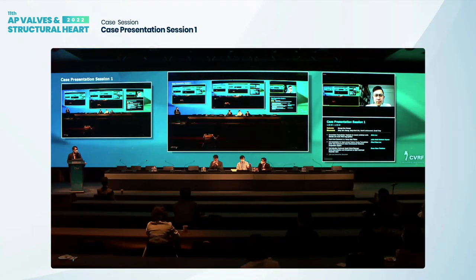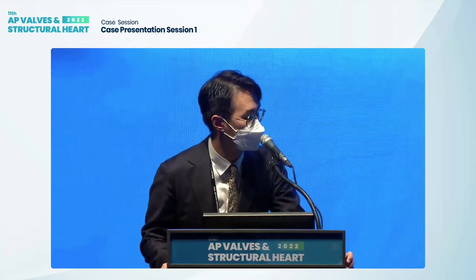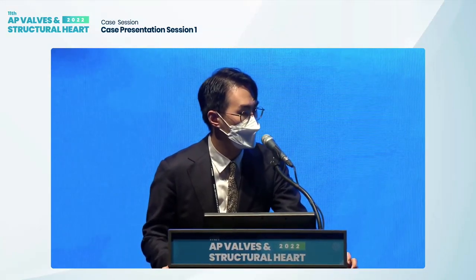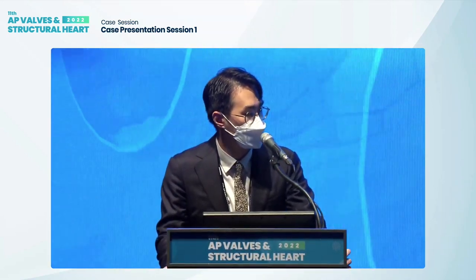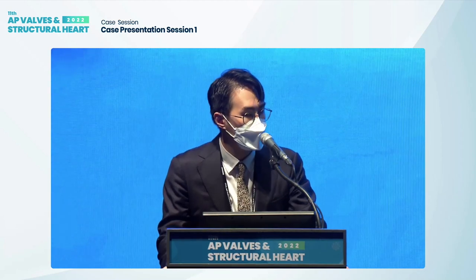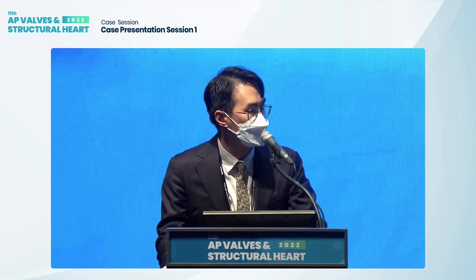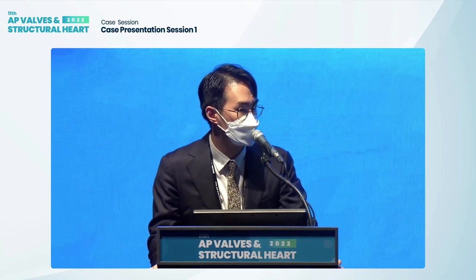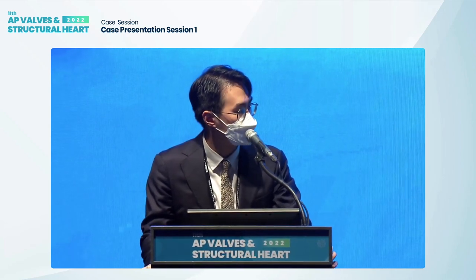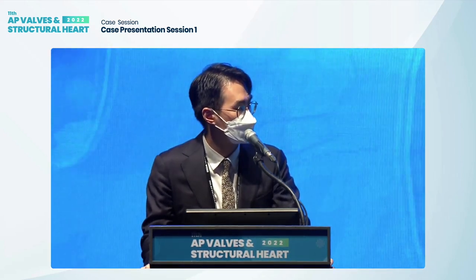Yeah, after the heart team discussion, the main problem of this patient was first the pressure overloading of the aortic stenosis, and so it made the chordal rupture and the backward regurgitation. So if we first try the MitraClip, the LV pressure is not solved immediately, so we first do the TAVR and solve the pressure overloading, and we next go to the MitraClip.